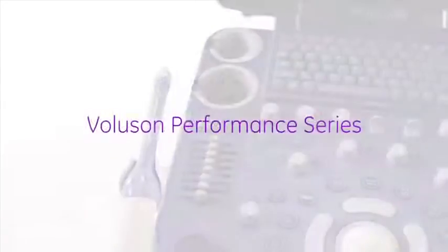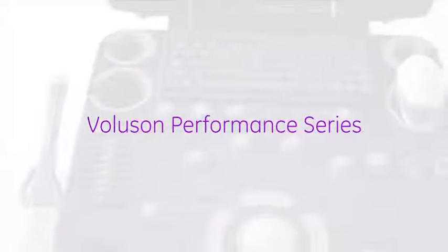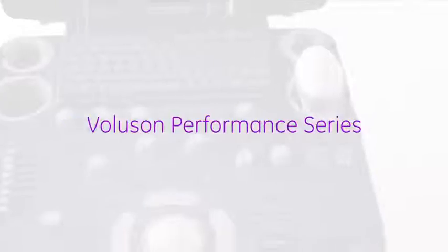The Voluson Performance series is an easy-to-use system with excellent image quality and performance to help meet the needs of your clinical practice.